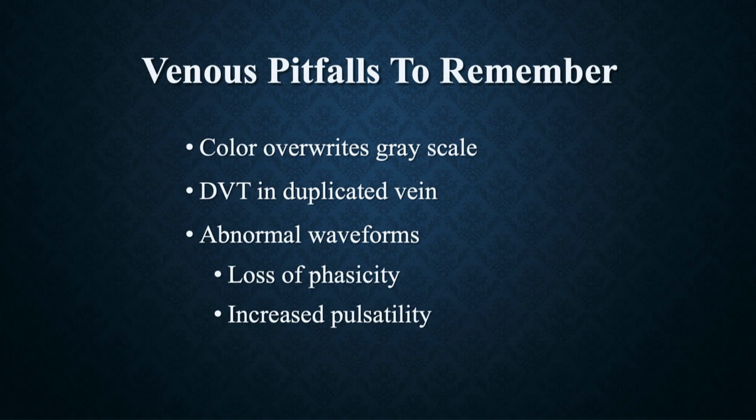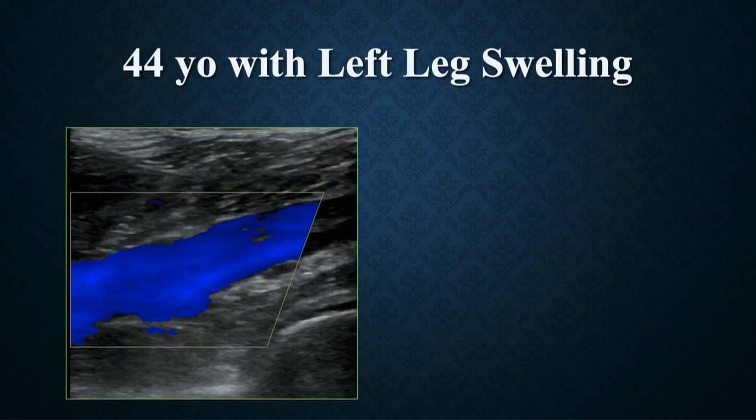It's not unusual to see duplications of the femoral veins, not at all. And of course, we talked about abnormal waveforms, losing the phasicity, so important. And we'll also look at a case of increased pulsatility. So here's another example, 44-year-old presenting with left leg swelling.